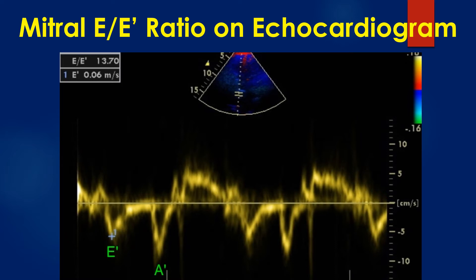After that, color tissue Doppler, also known as Tissue Velocity Imaging or TVI mode, is switched on to assess tissue Doppler. The cursor is placed over the medial mitral annulus and the tissue Doppler tracing is obtained. E prime velocity is then measured and stored.